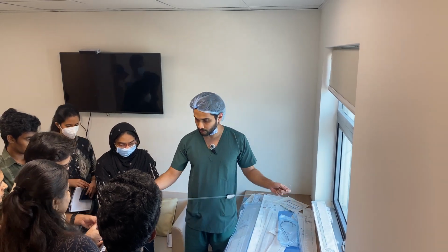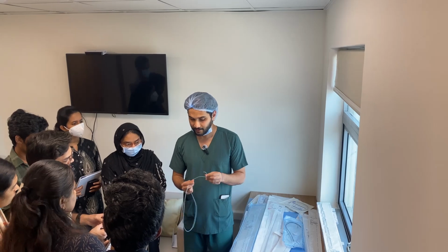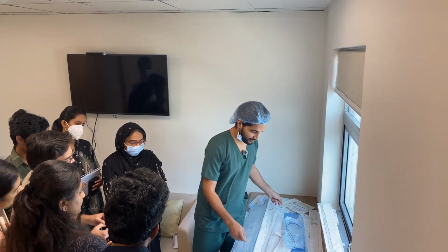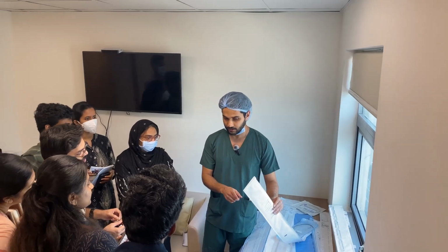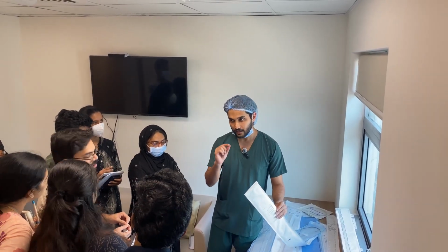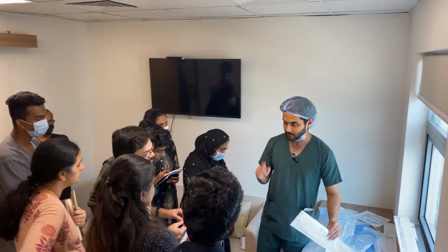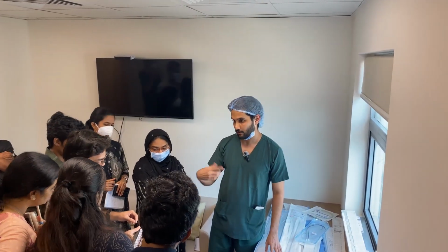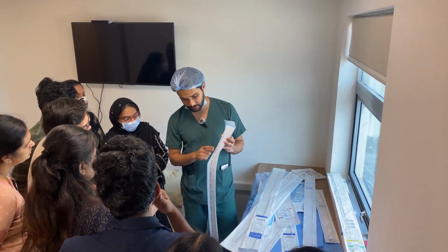അപ്പോൾ മെയിനായിട്ട് ഒന്ന് നോക്കേണ്ടത് ഇത് ബേൺസ്റ്റീൻ, ഇത് കോബ്ര. ഈ വളഞ്ഞിരിക്കുന്നത് സിം 2 ആണിത്. ഇതുപോലെ ഇതിന് ചെറുത് സിം 1 ഉണ്ട്. പിന്നെ സിം 1 എന്നാണ് ചുരുക്കി വിളിക്കുക. ഇത് C1, കോബ്ര 1. ഇതാണ്. ഇത് മാർക്കർ പിഗ്ടെയിലാണ് ഈ കാണുന്നത്.